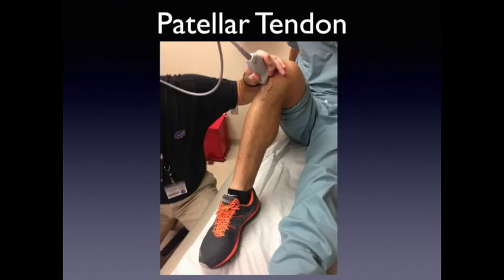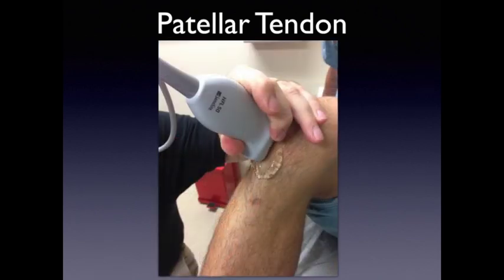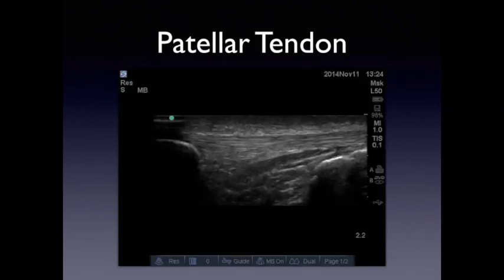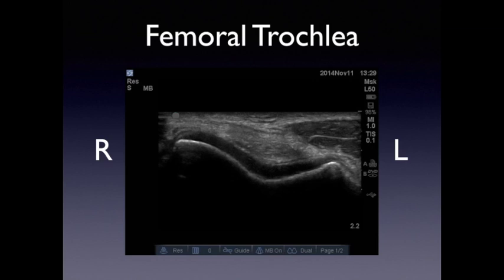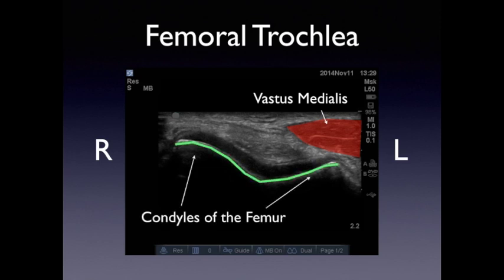We're now going to look at the patellar tendon, scanning in a sagittal orientation with the transducer placed longitudinally. On the left side of the screen is the superior portion — the patella — and inferiorly the tibia, with all the fibers of the tendon visible. If we move to a transverse position near the distal femur, we'll be able to see the trochlea of the femur and a segment of the vastus medialis. Hyperechoically you see the condyles of the femur and then the articular cartilage.